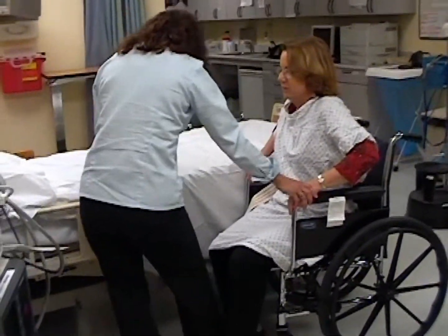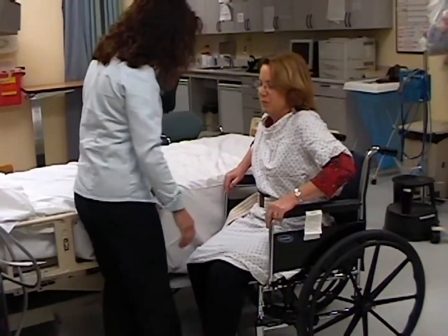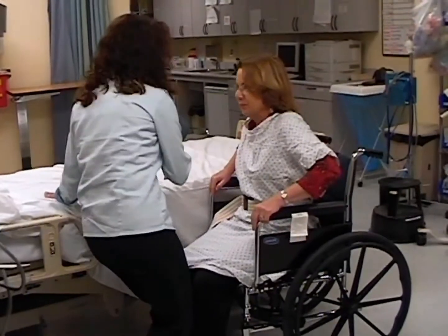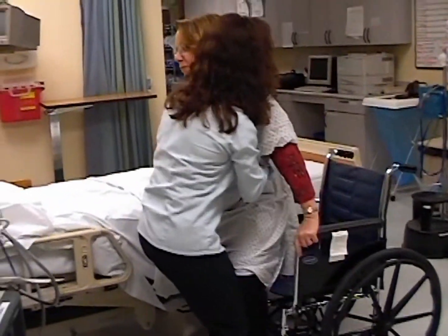We lower the bed as much as we can. In this case, it doesn't lower that much. So with this strong leg, I want you to stand up, and then we're going to guide you back into the bed. Okay, ready? 1, 2, and 3. Okay, and return.